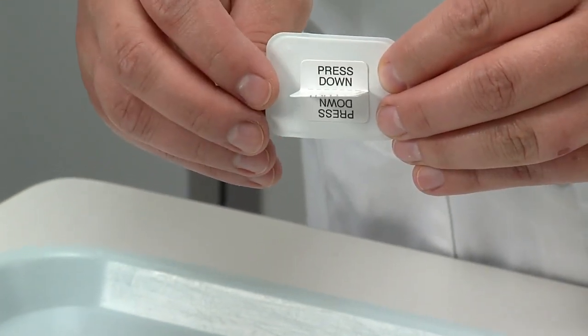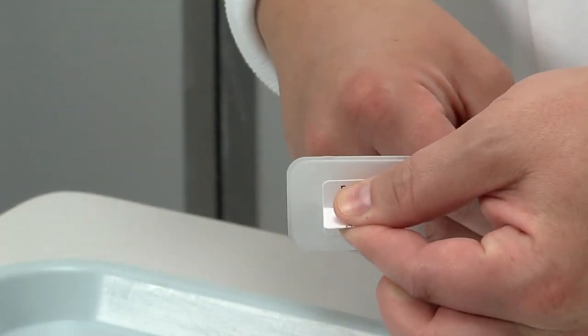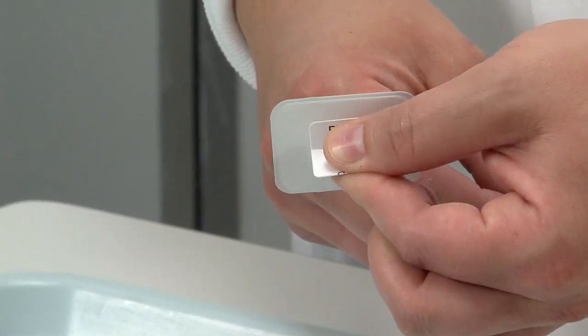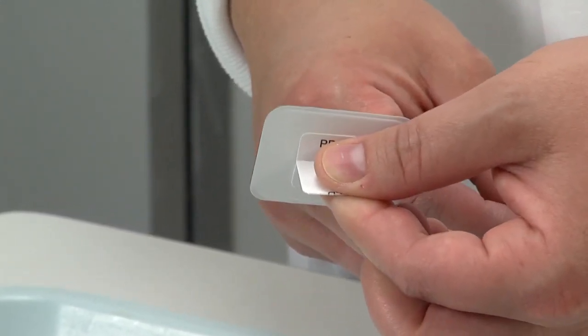That way when the patient bites down, they will actually be occluding here on the tab, and the film will be extending to get the maxillary and mandibular crown area.